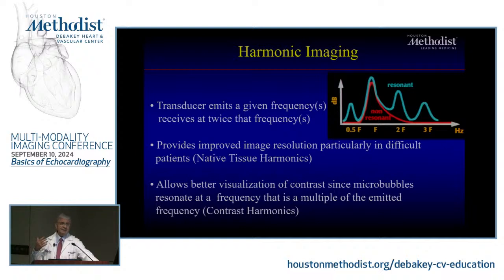And maybe your best depiction of such is, if you're a string player, if you're a piano player or guitar player, if you hit that chord hard enough, you will hear more than the fundamental frequency that that string will send. Okay? If you want to imitate it, bang, versus bang, okay? They're lower, different sounds. So what does this have to do with ultrasound?